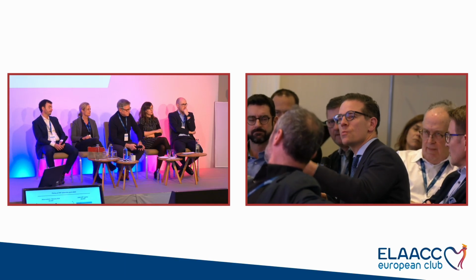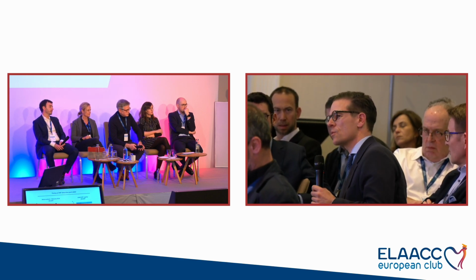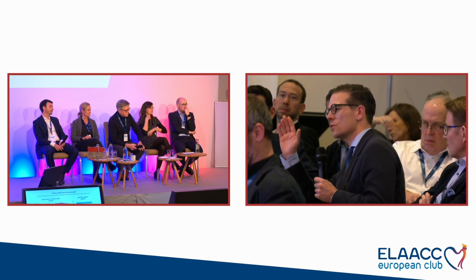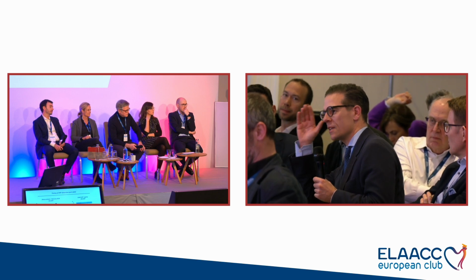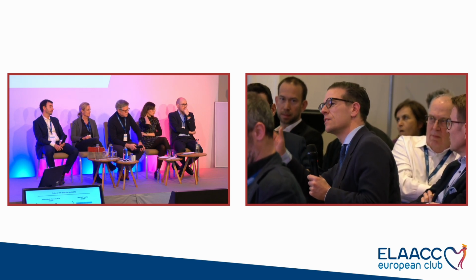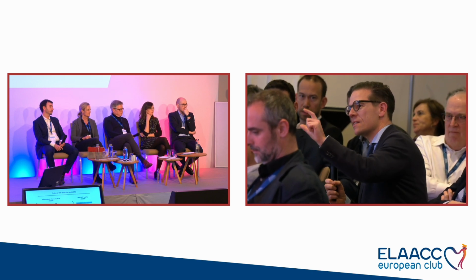So at our institution, we started at 5 years with routine follow-up, and the radiologist always wrote patency. And of course, this creates lots of confusion, not only for the referral doctor, who of course reads the CT report, and we had a meeting and we brought them to write clinically non-significant contrast patency.